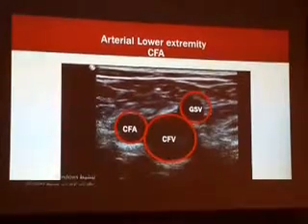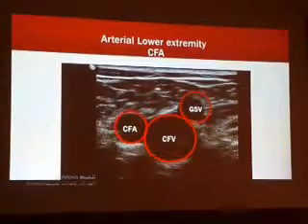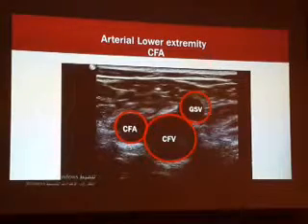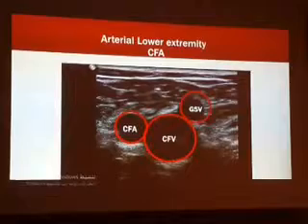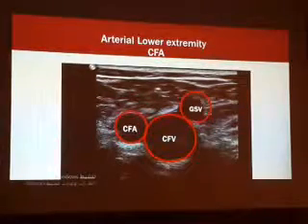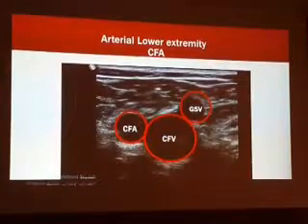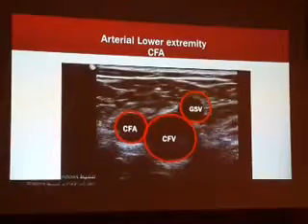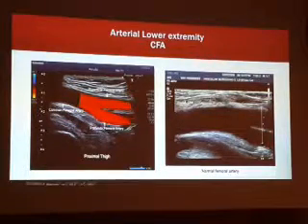In a vascular assessment, always locate your vessel in a transverse position. Don't go sagittal, it will confuse you. Go directly in transverse, and once located, it's easy to follow. When you chase the circle, it's easy to drift sagittal, medial, or lateral. No, follow the circle. It's easier to follow a circle. So once you're located in transverse, go in a sagittal view. You will see it easily, and you will see the bifurcation.